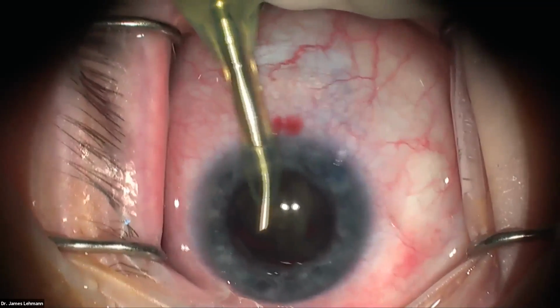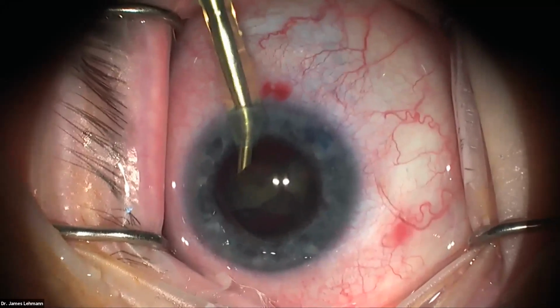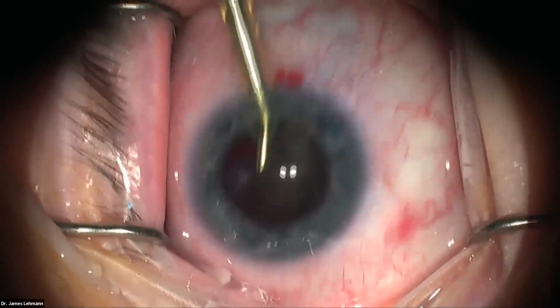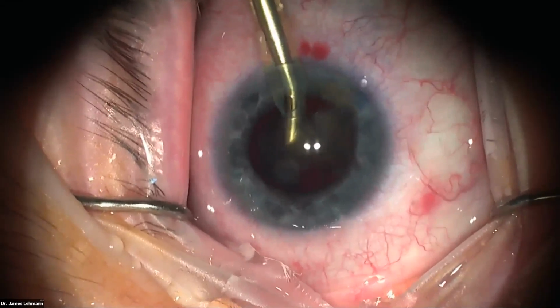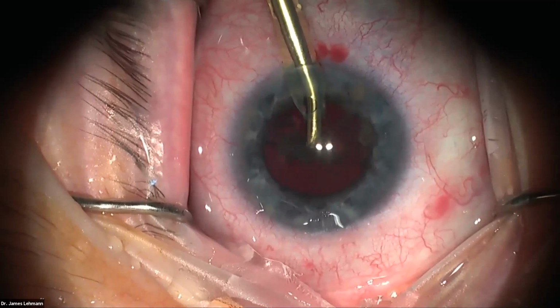And then this last piece, I eat a little bit higher and not necessarily in the iris plane, because I do want to keep that posterior capsule from trampolining up. And I'm using that burst mode and trying to just keep it dancing on the tip. And you can see just patience.